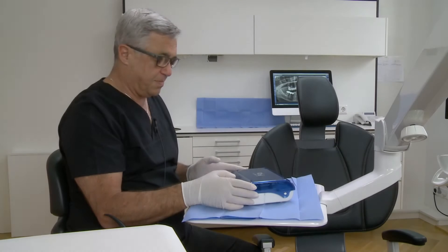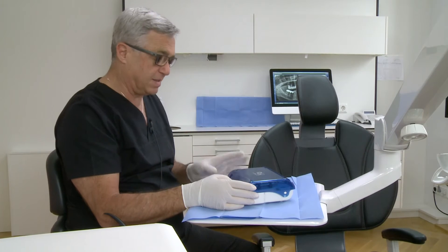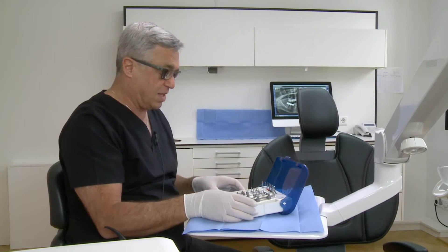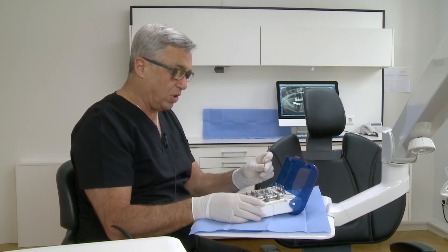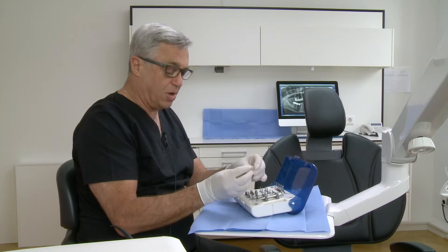Today I will use the BHI implant system and I would like to show you, before we start the surgery, the contents of the surgical kit. Every implant procedure starts with a marking drill, which can be a pointed one or a round burr.